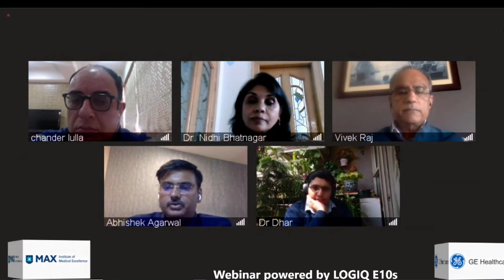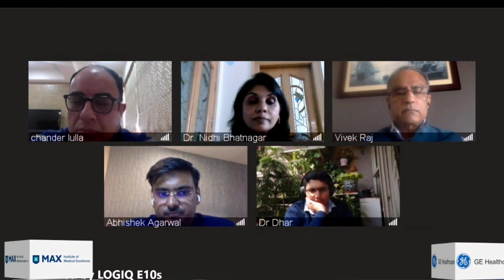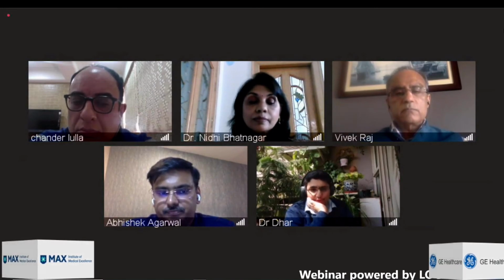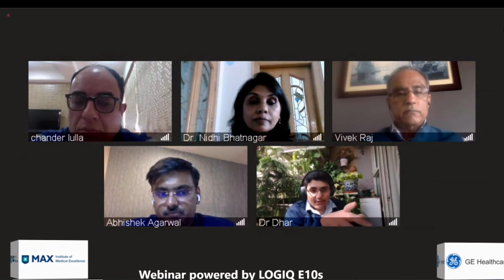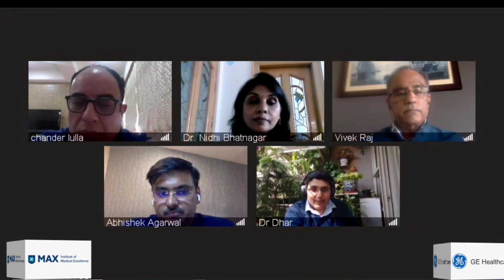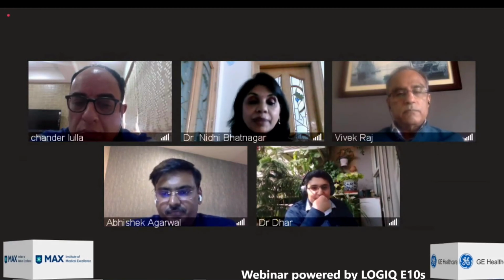It also depends upon any deterioration in the patient's clinical situation. Correct. And so I would prefer to do an ultrasound 6 monthly, but everything else depending on the situation. Sometimes you would also want a CT and alpha fetoprotein. Right. And coming to your question regarding the FIB4 and ultrasound and elastography, I think we can find a corollary in acute pancreatitis, the difference between a BISAP and a CT severity index score. So it's something like that. BISAP. Okay. Yeah. I agree there.